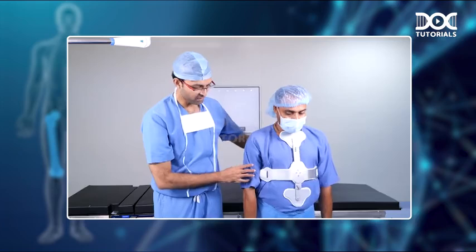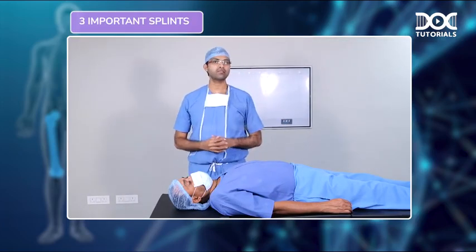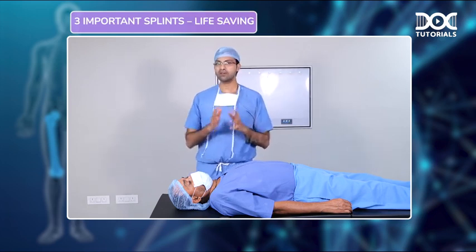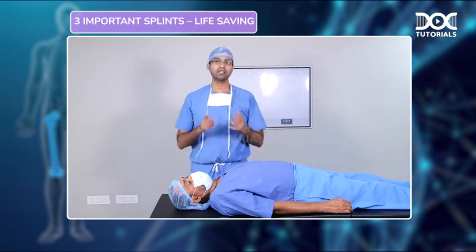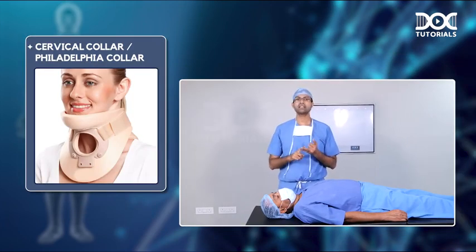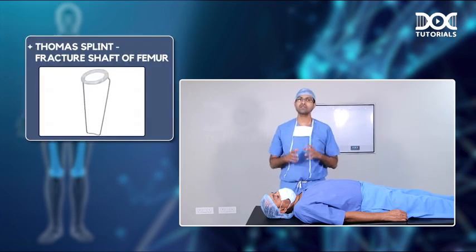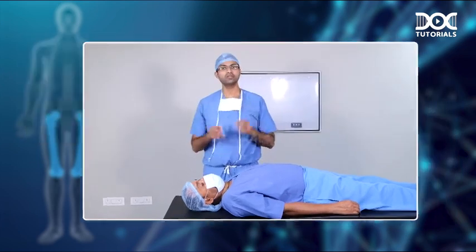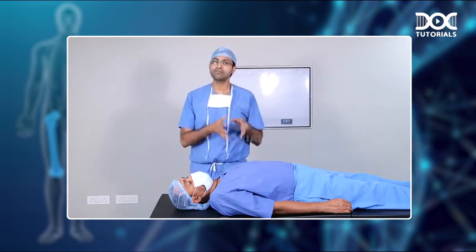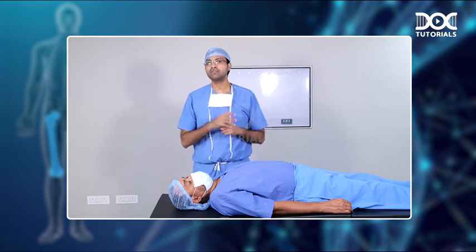Can you turn forwards? So now we are going to discuss three of the most important splints that we have to know in orthopedics. These three splints can be life-saving for the patient. Which are these three splints? First is your cervical collar, Philadelphia collar. Second is your pelvic immobilizer, and third is your Thomas splint, which we use for fracture shaft of femur. These three devices are very, very important in your emergency department, because if you apply these splints correctly at the right time, you can save the life of the patient.